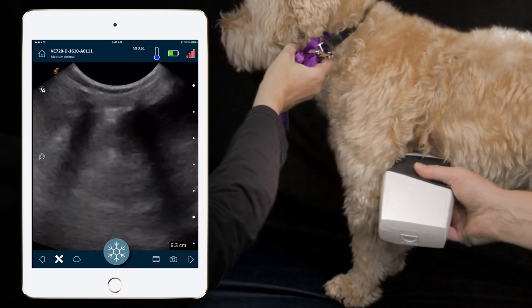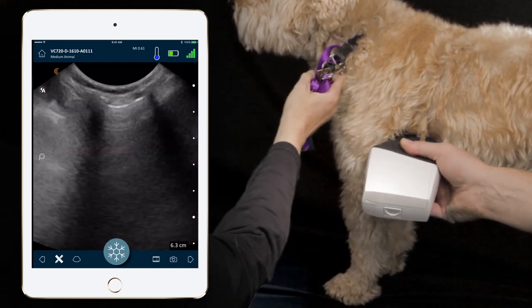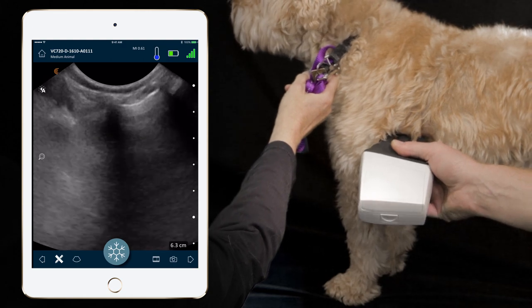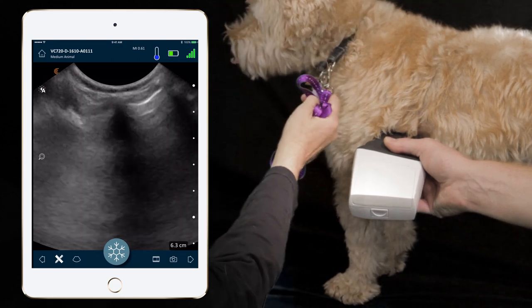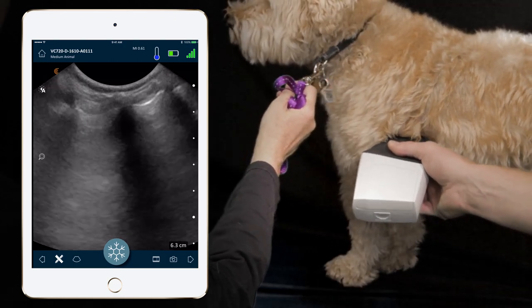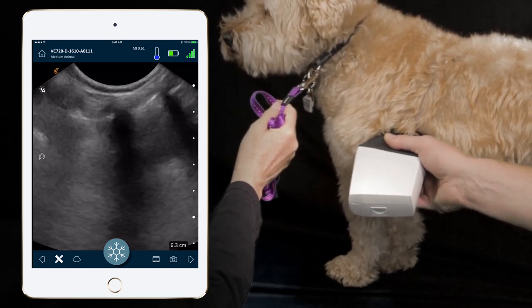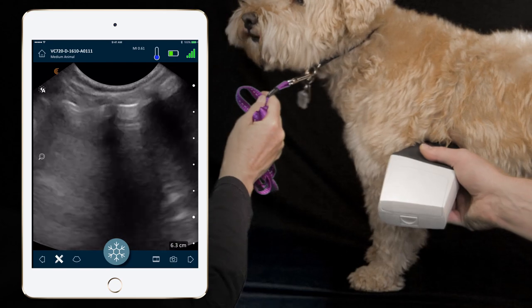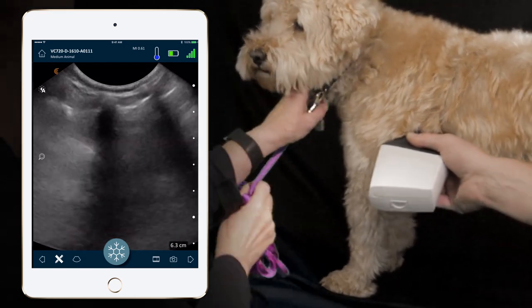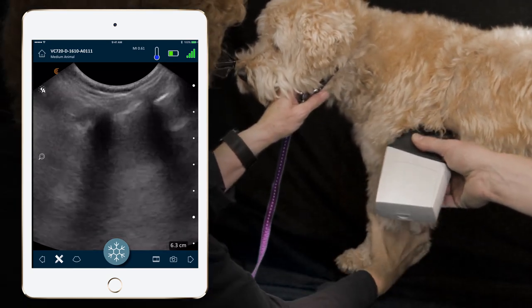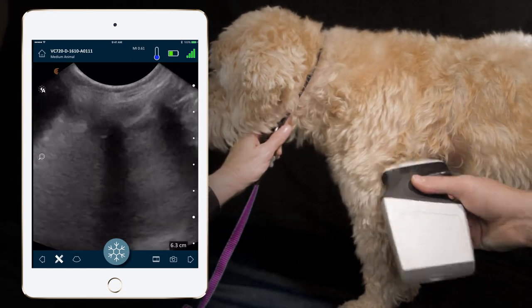We'll put a little more alcohol in the perihilar region and come down. We can find movement to represent the heart, and then move the probe dorsal to the heart. If we have a glide sign dorsally, we've already ruled out pneumothorax caudal dorsally, so at this site we mainly look for the presence of B-lines. We can move the probe around — a little cranially, a little dorsally — looking for that vertical white line representative of a B-line. That's our perihilar site, the second region we examine.